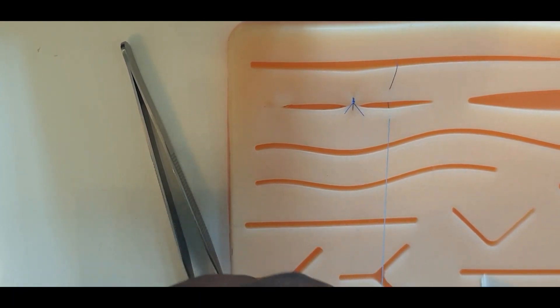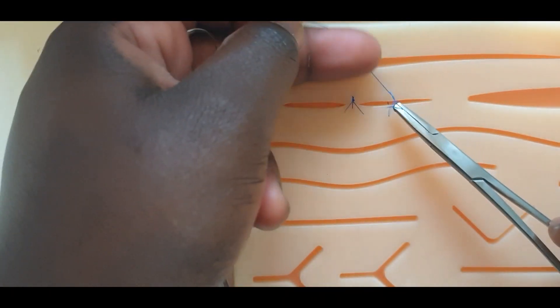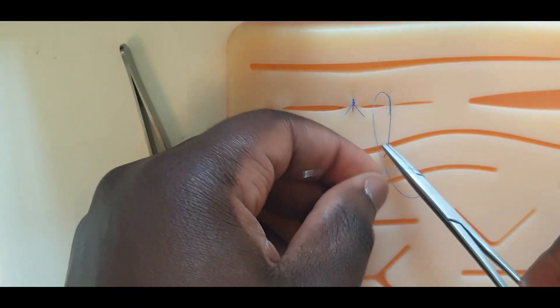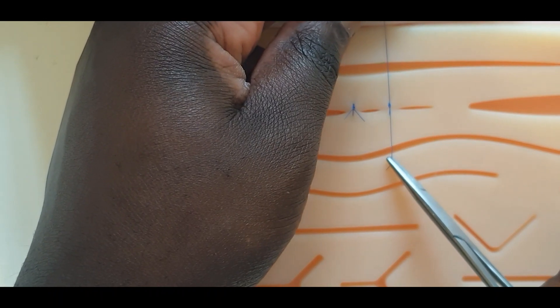This is performed by following your surgeon's knot with a reef knot. But the long and the short thread go back to the same positions they were laid after the surgeon's knot.